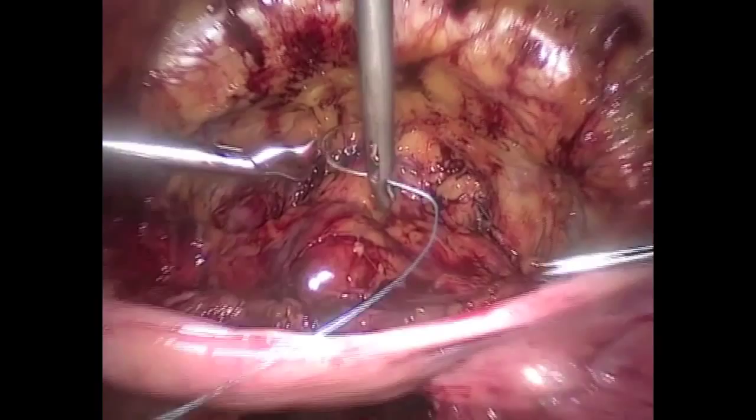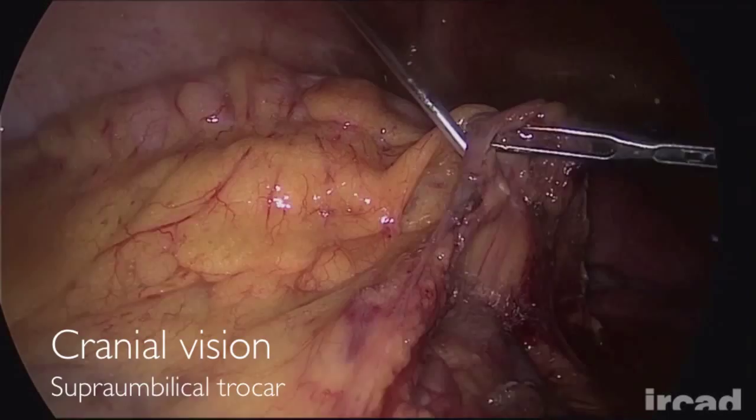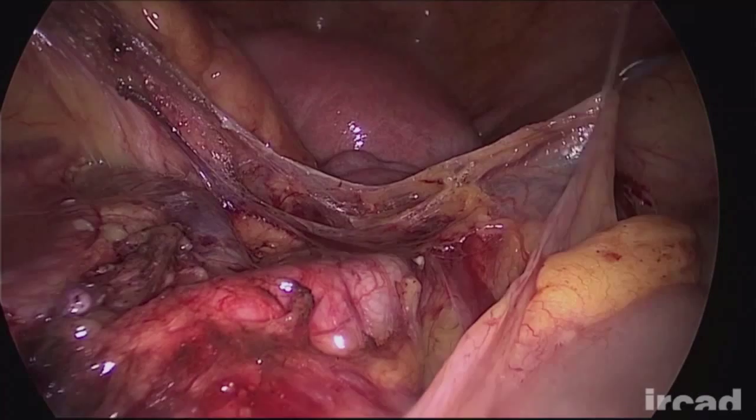Adequate exposure of the surgical field is mandatory during lumbar aortic lymphadenectomy, particularly in obese patients. The suspension of the peritoneum by means of T-Lift devices is a useful alternative to improve the visualization of the area. In addition, the tent shape of the lifted peritoneum keeps bowel loops outside of the operative field.